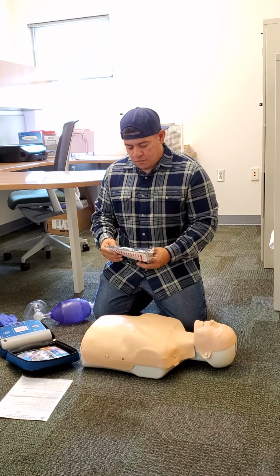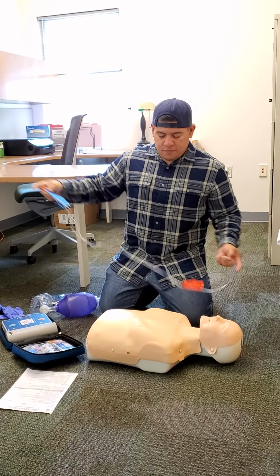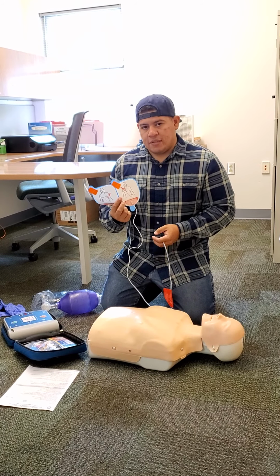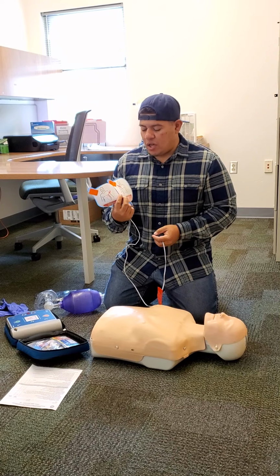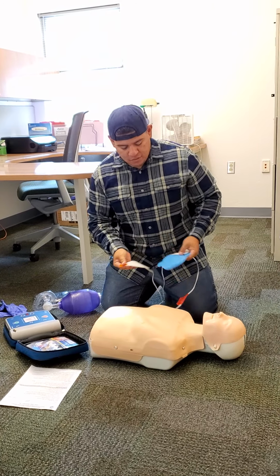Apply pads to the patient, who would be bare, doing chest compressions and ventilations if he had a partner on scene. Plug in the pads connector next to the flashing light. And your pads have on them a diagram that shows you exactly where to place them on your patient. Apply pads. Plug in connector.